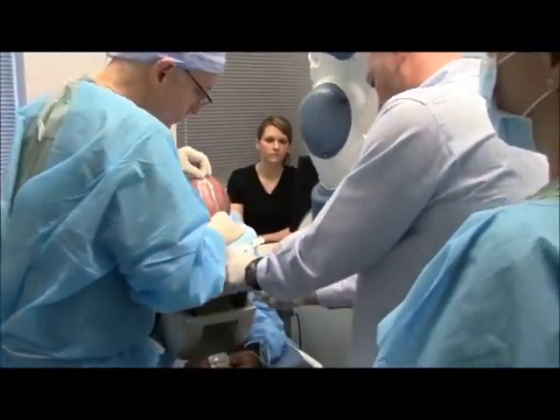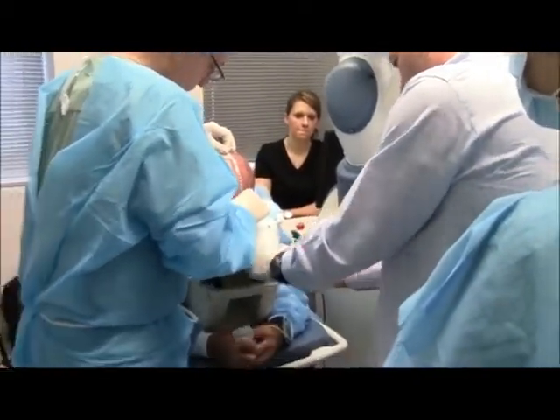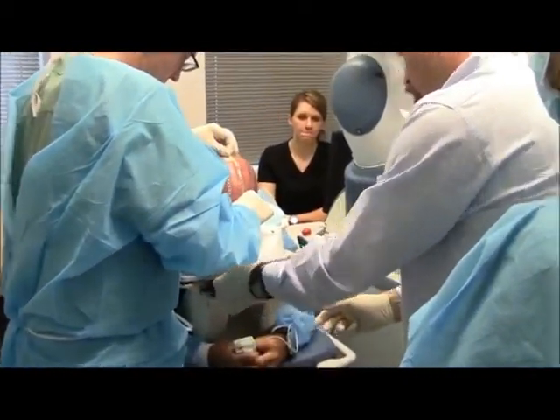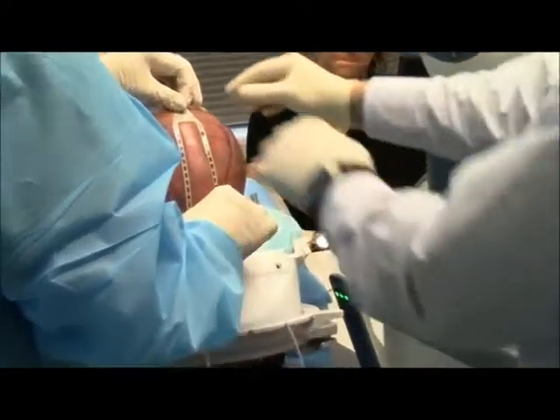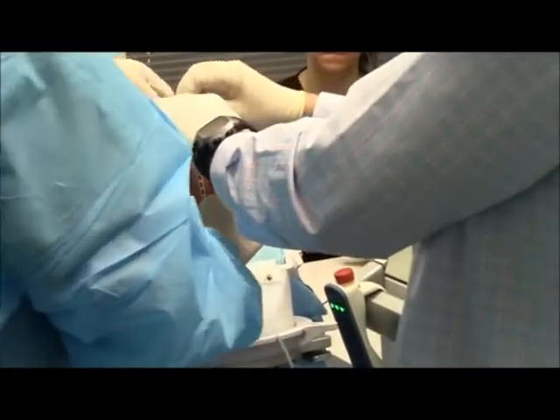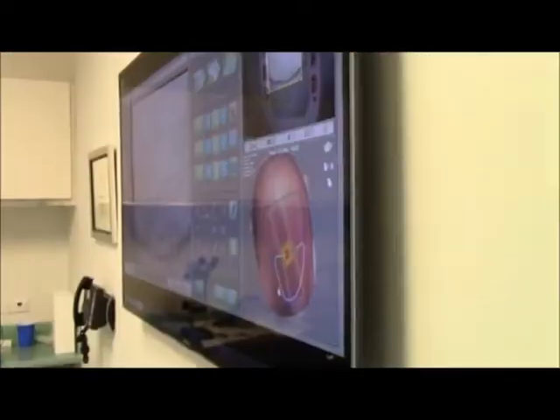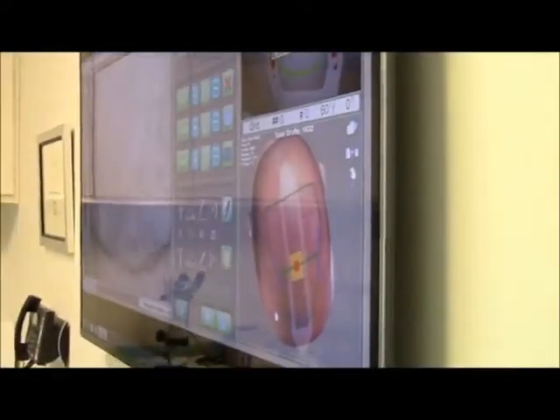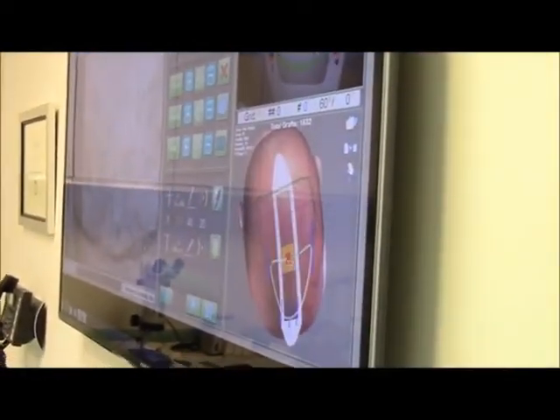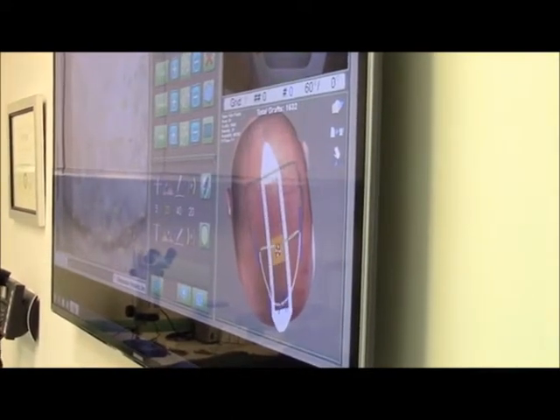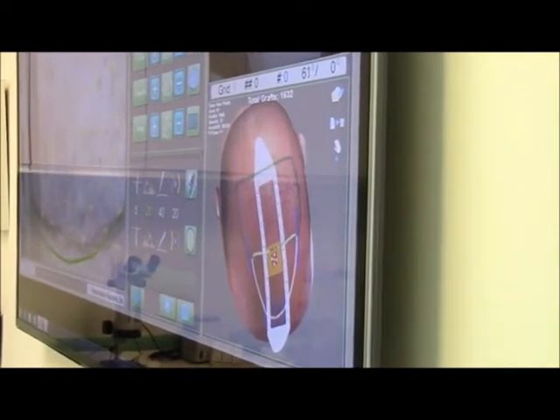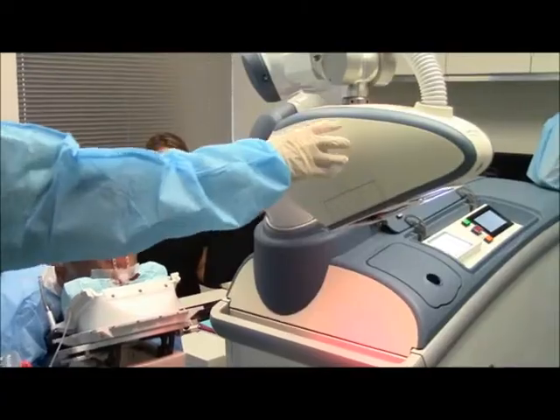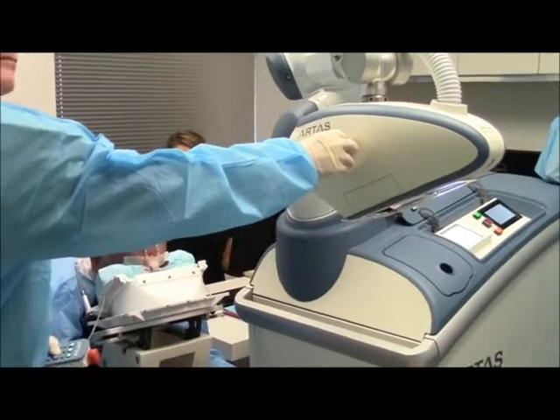I'm placing the fiducial on the patient's head. This allows the robot to orient itself. You can see that they're vertical, so the robot is going to go up and down when it makes the recipient sites. And this is the digital projection of the same thing.